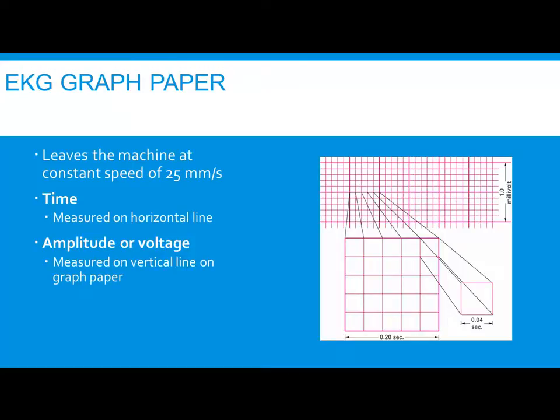Okay. ECG graph paper. So what I want you to do is take your paper, get you a pencil, pen, whatever. Alright, I want you to have it sitting in front of you just like this, where you see the printed side. In the United States, it is at your chest. Alright? That's the way that you're looking at it. Okay?